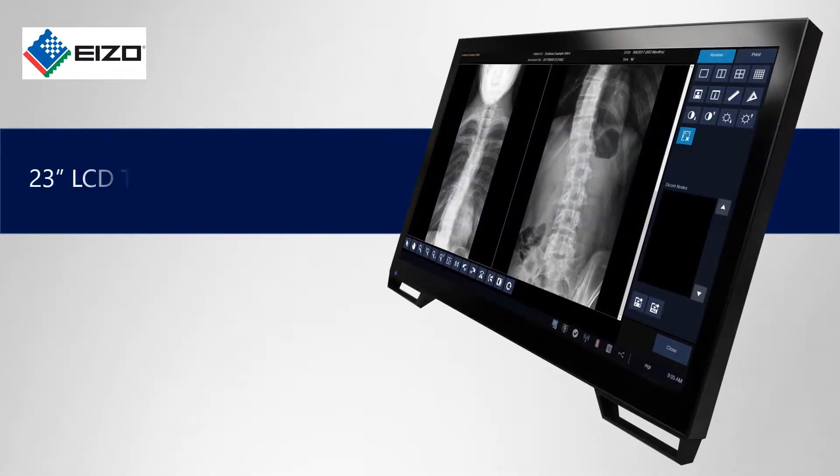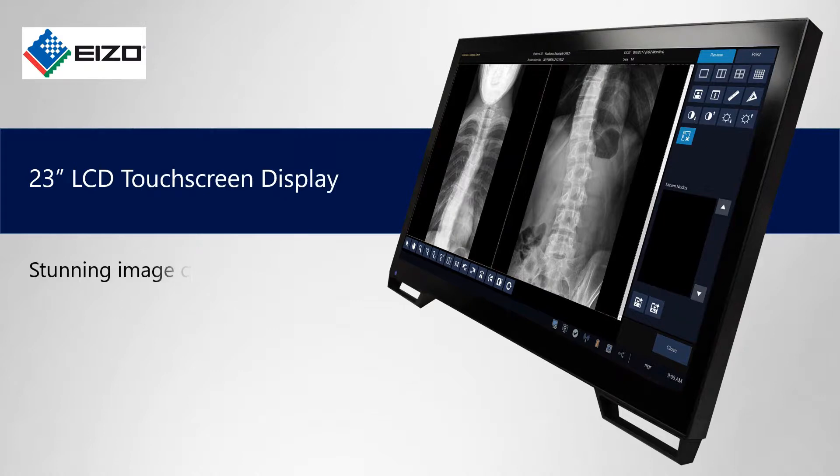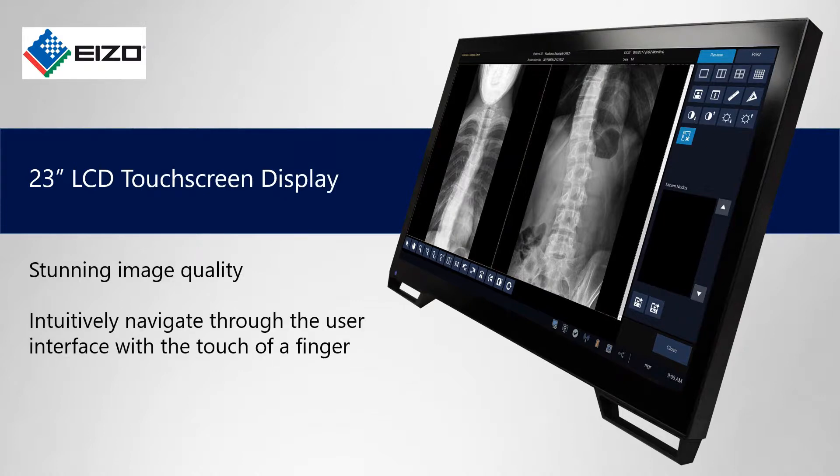The DellWorks workstation includes a high resolution 23 inch touch screen display for stunning images and easy navigation with the touch of a finger.